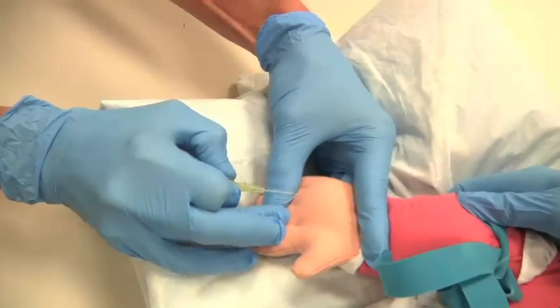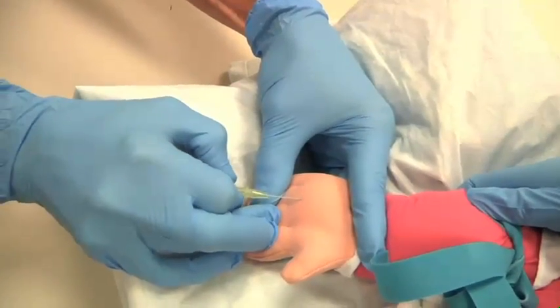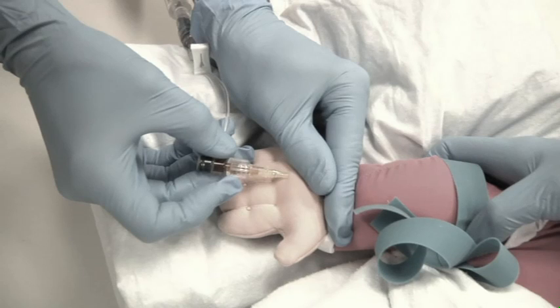Do not touch the intended insertion site after prepping. Penetrate the skin and vein wall at a 15 to 30 degree angle, which may vary according to the depth of the vein. Advance the catheter until blood return is noted in the catheter or flashback chamber. Lower the angle of the stylet and push the catheter forward slowly into the vein. Remove the stylet, making sure the safety mechanism is engaged.